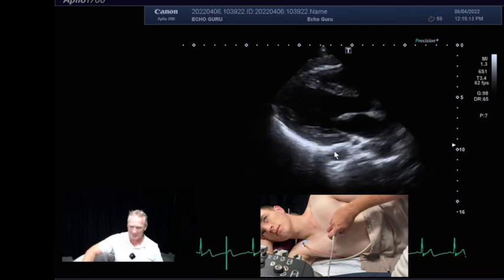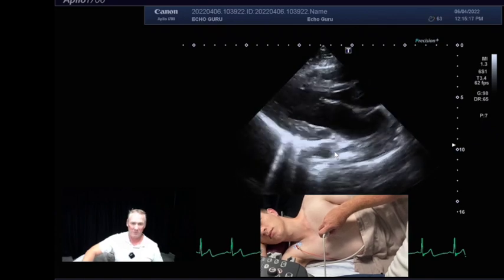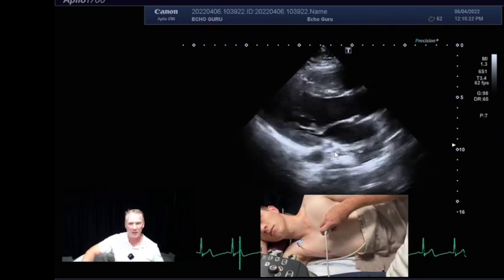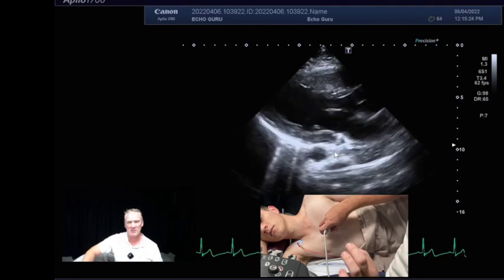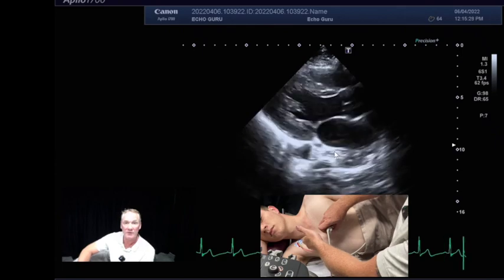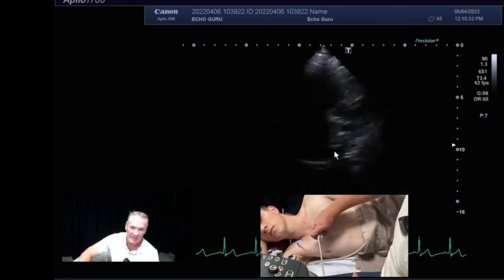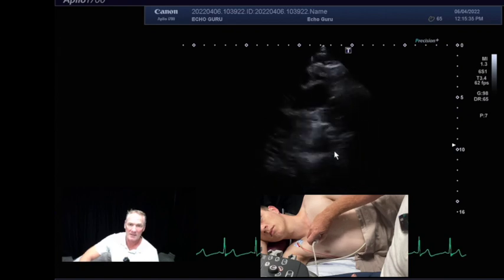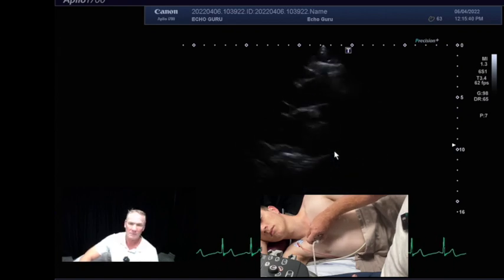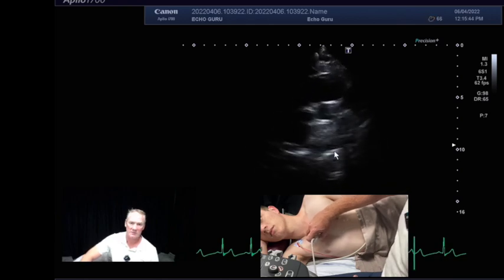In this instance, we can see the left ventricle nicely in this position. That's not normal that we can see that. Normally that's obscured by the lungs and we don't get as nice a picture. But it's perfect in this case because it really shows nicely the direction that the heart's lying relative to the aorta, relative to the sternum, and that if I follow that line along the index marker, I'm going to end up at my ascending aorta. And so here we've got a nice right sternal edge view of the aorta.